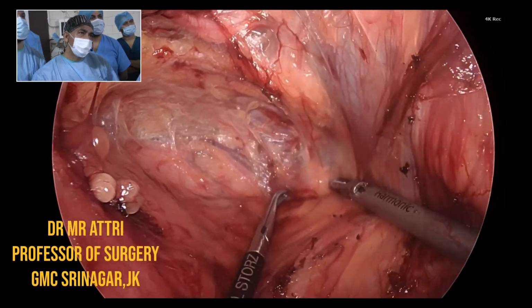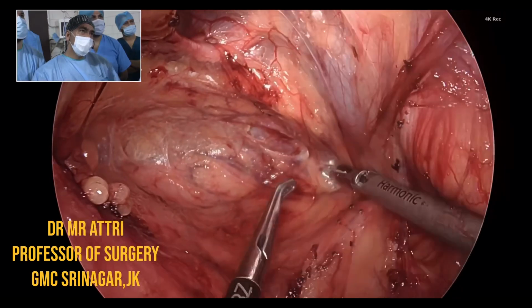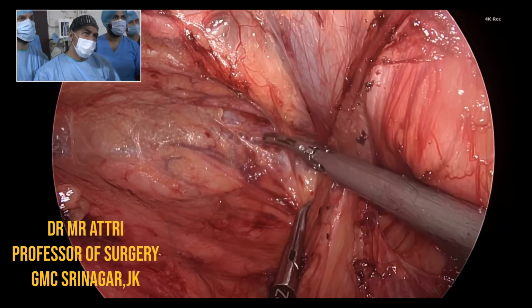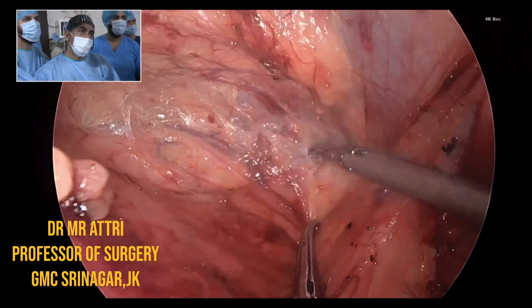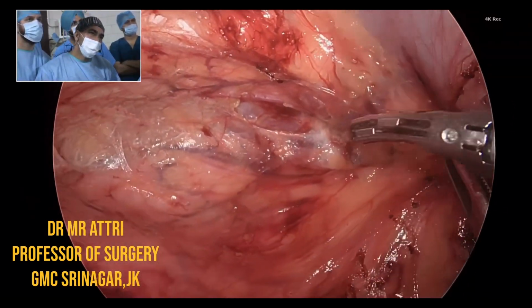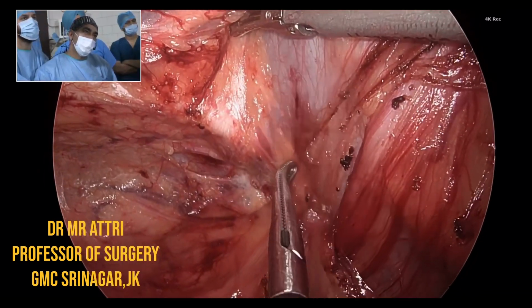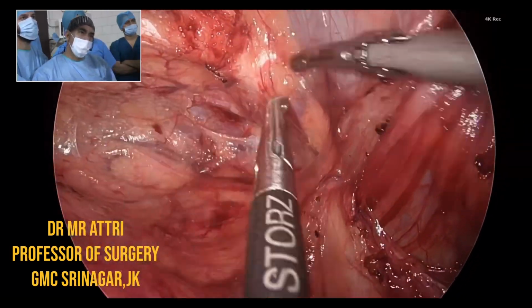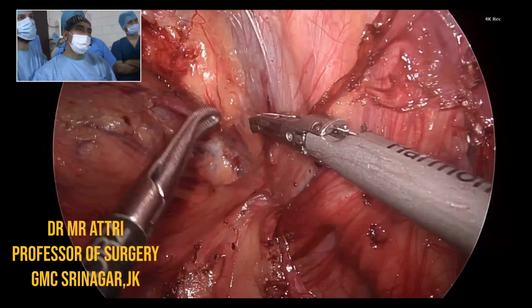Now we have catheterized him, so his bladder is down. We should not dip here too much because there is the obturator nerve. Since he doesn't have any obturator hernia, there is no need to poke here, and you can see these vessels. Yes, we can see them clearly. These are the vessels. This is what we call the circle of death, right? These are vessels. We should not rub over these vessels. We should not apply any tacker over these areas.